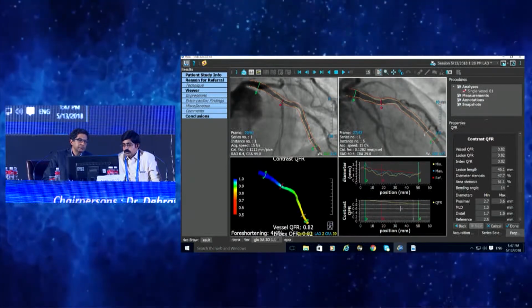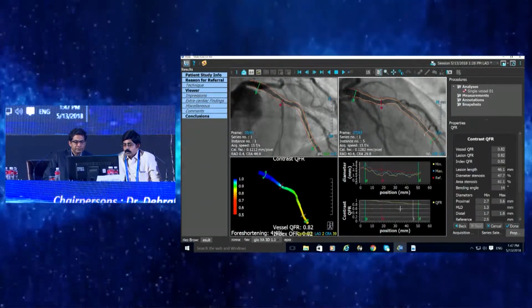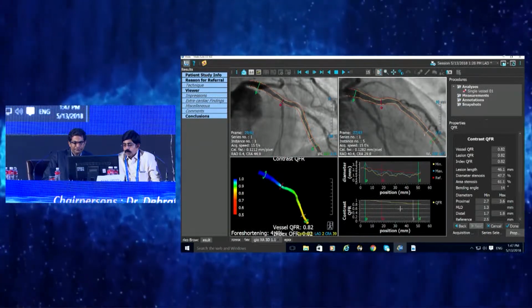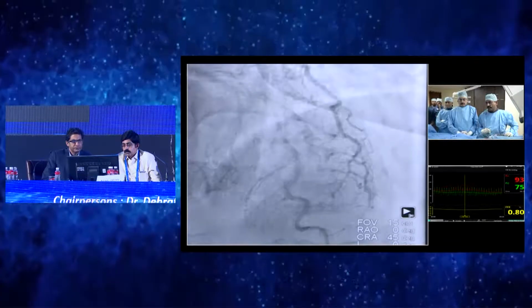That's where we are, and in the process, because the patient is already taken, we can show today's live pictures. That's the value. It came like this on the diagnostic picture, and it all correlated. We thought we would decide and do stenting for the LAD. Do you agree with those things?